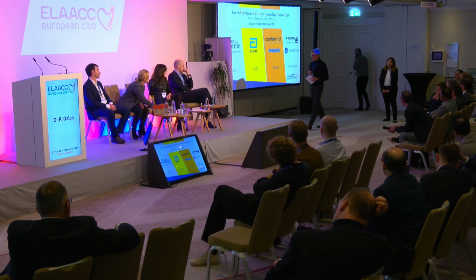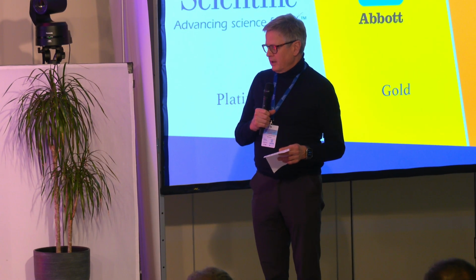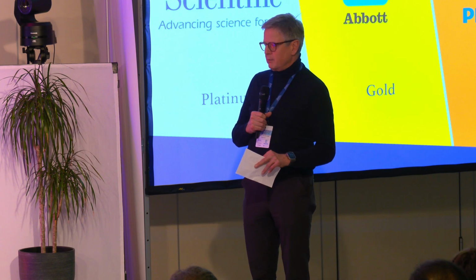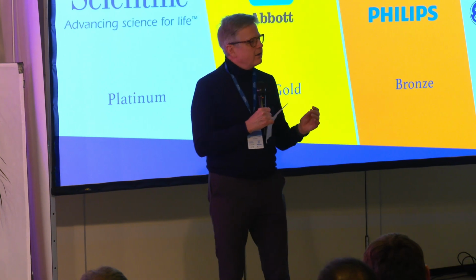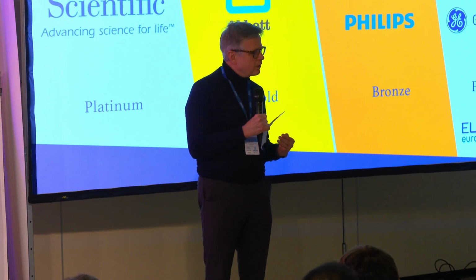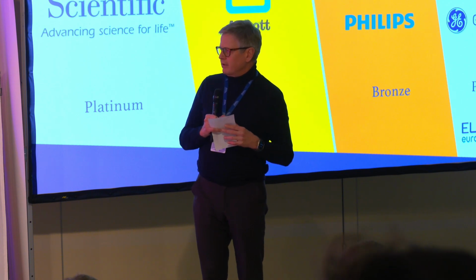I want to add one thing to the discussion about timing of follow-up, because we alluded to device healing and endothelial overgrowth. It's not just ingrowth of a single monolayer of cells over the device. That's not the natural history of device healing, because we have done early scans and it starts with a flat layer of thrombus that can be a kind of scaffold for tissue ingrowth, and then with time this will regress and an endothelial layer is left behind.